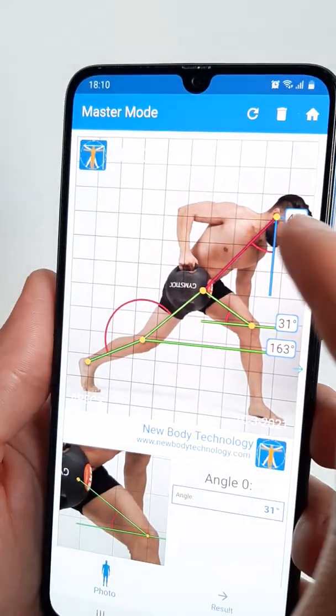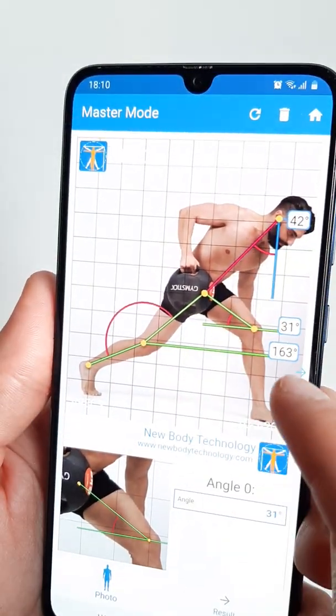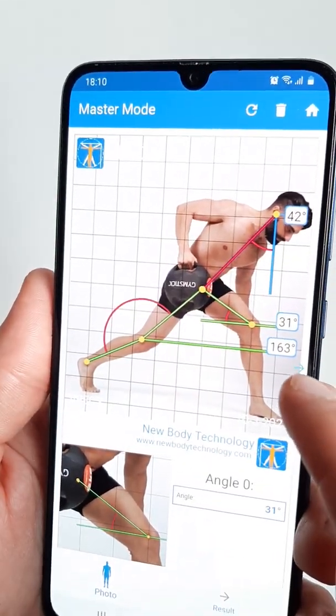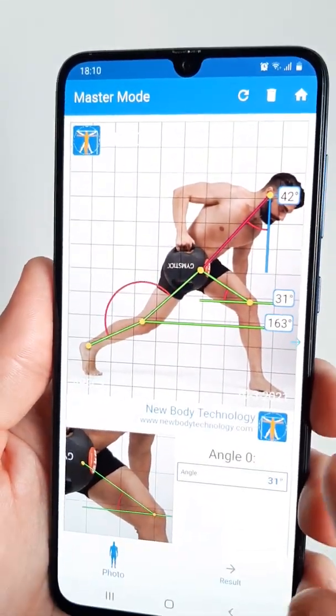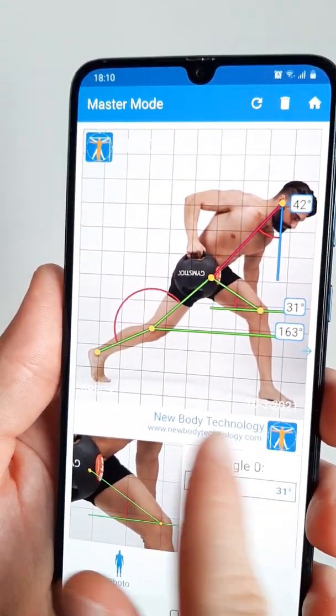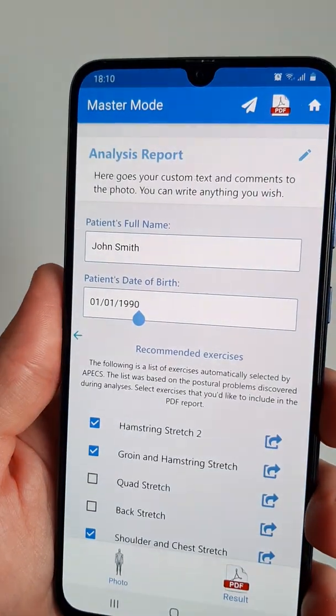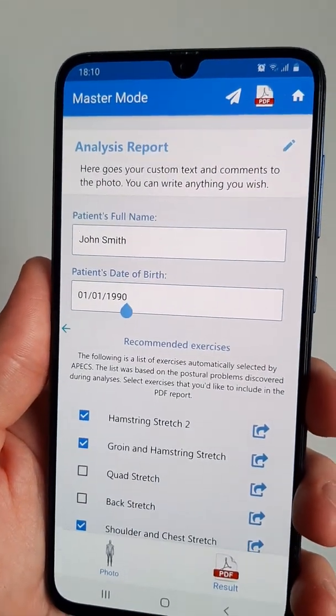Once you've positioned all the angles and drawn everything you wish on the photo, you can slide to the right to access the results section.